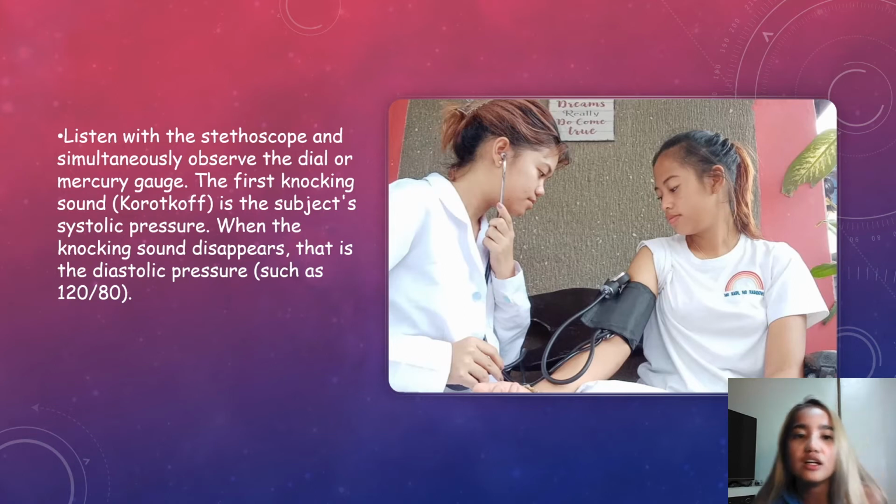The first knocking sound, also known as the Korotkoff sound, which we will be discussing on the next page, is the subject's systolic pressure. And when the knocking sound disappears, that is known as the diastolic pressure. Example, 120 over 80 mmHg. The 120 there is the systolic and the 80 is the diastolic.